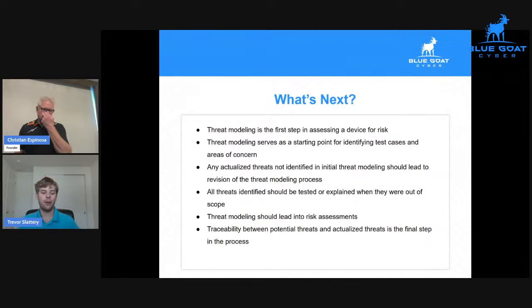Exactly. And even that, when you look at the threat modeling process, that itself can be a threat. We go back to STRIDE. That's denial of service. What if you do 3 incorrect attempts and it locks you out for 10 minutes? That's really bad to have on a life-saving device. So doctors need to be able to get in quickly, but the device still needs to be secure. So what's the middle ground? We can have a quick pin on the device. We can have it not connect to the internet, so you can't try to brute force the pin. There are a lot of things that we can do to get around that. So generic fixes for just general cybersecurity problems aren't always going to work here. That's why considerations for a medical device are so different compared to a typical network or a typical product.